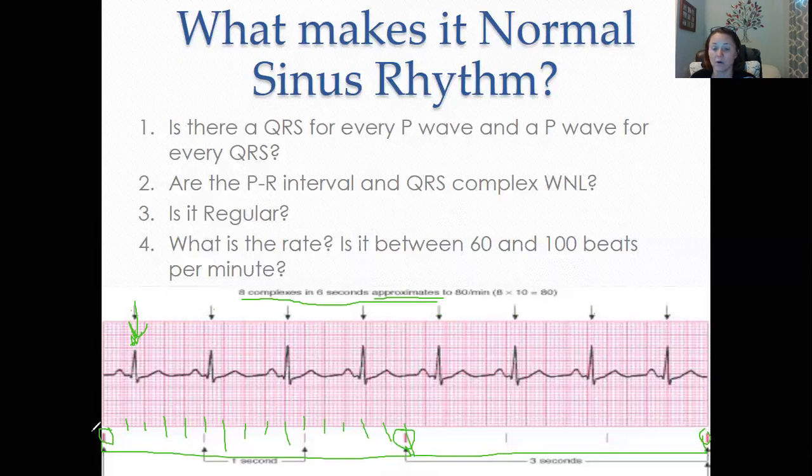There are other ways that we can do it. That is the easiest. If you have tick marks at the bottom of your paper, that's the easiest thing. You can also write your own tick marks if there aren't any. You could count out those boxes just like I did down here, and count out your boxes to get to where you need it to be.